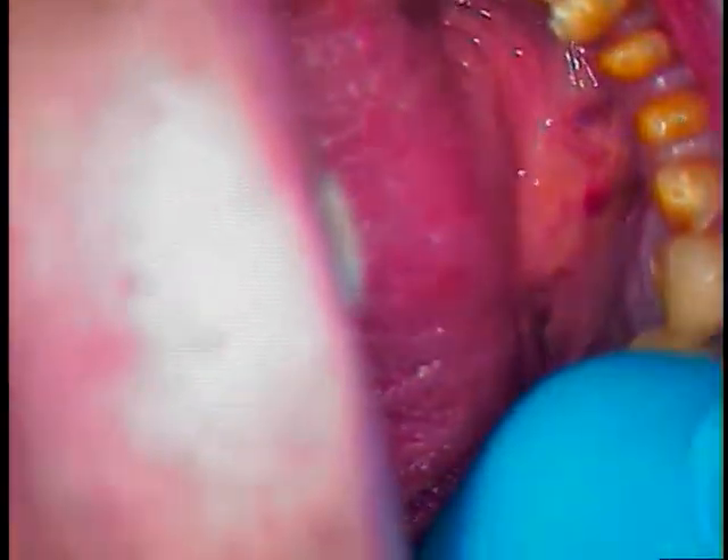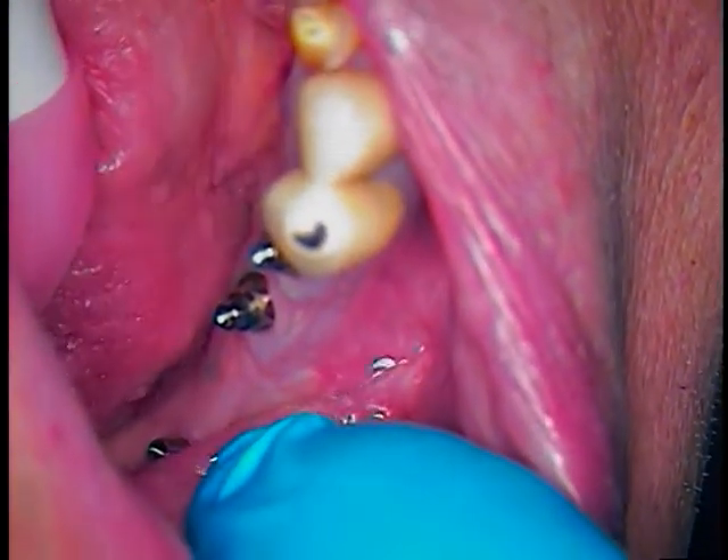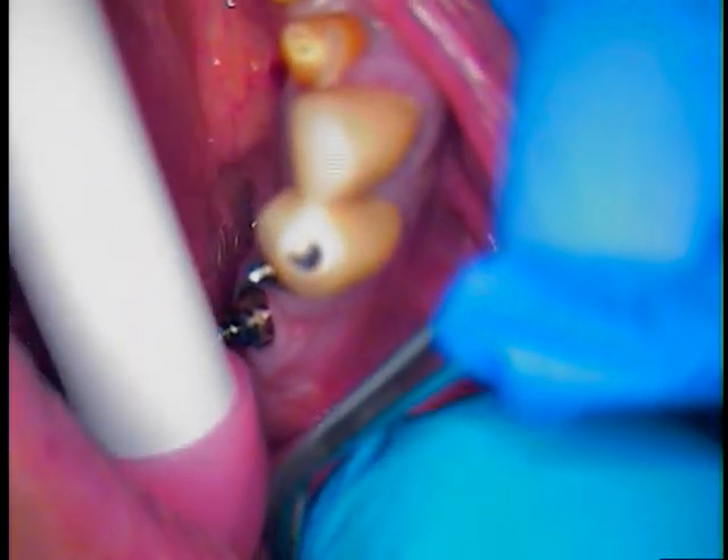Now I can take out that prosthetic screw that helped me tremendously. I wasn't able to hold on to that abutment without that prosthetic screw in there. You're going to live and learn. Now take the prosthetic screw out and just set it aside. It's free — it's under my finger. There it is.